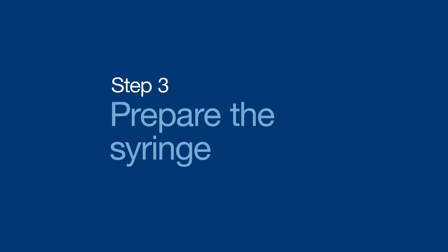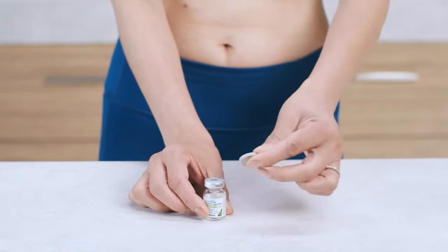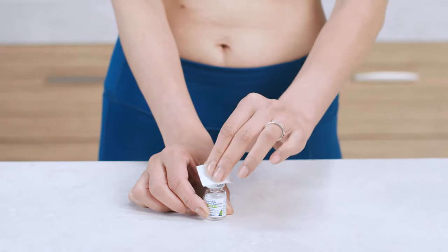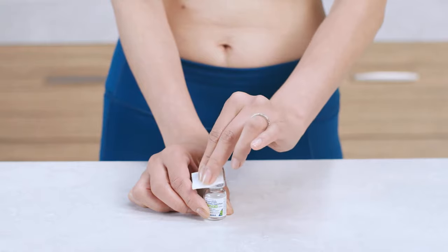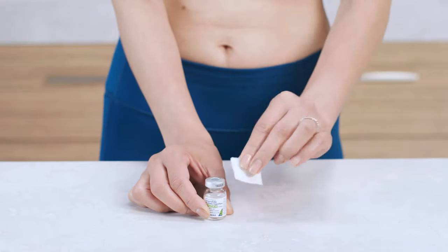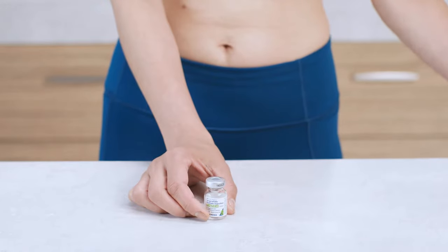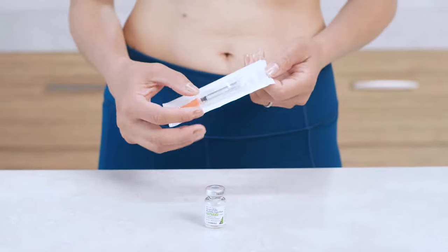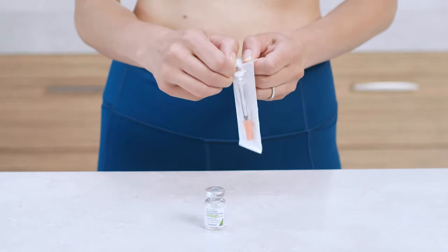Your next step is to prepare the syringe. If you're using the vial for the first time, remove the cap and wipe the top of the vial with an alcohol swab. Just remember to do this every time you reuse a vial. Also, if the solution isn't clear or you see any particles floating around, don't use it and call your healthcare provider right away for next steps.